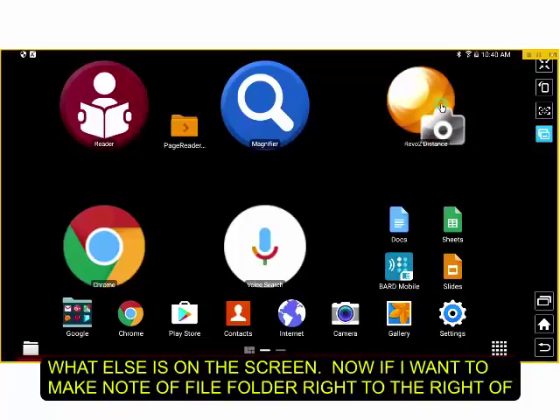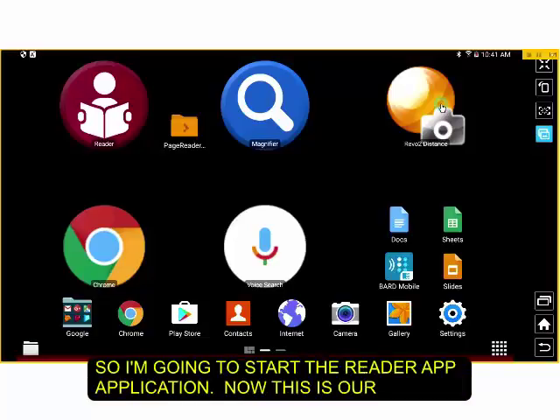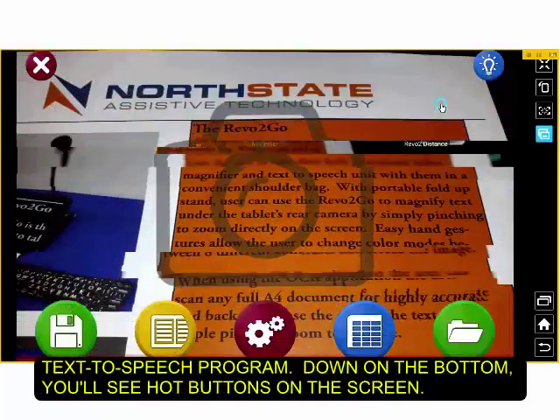If I go to the top left, that's our Reader application. But I want to make note of the file folder right to the right of that. And that's actually the page reader text files. So that'll be important when I show you the Reader app now. So I'm going to start the Reader application. Now this is our text-to-speech program.